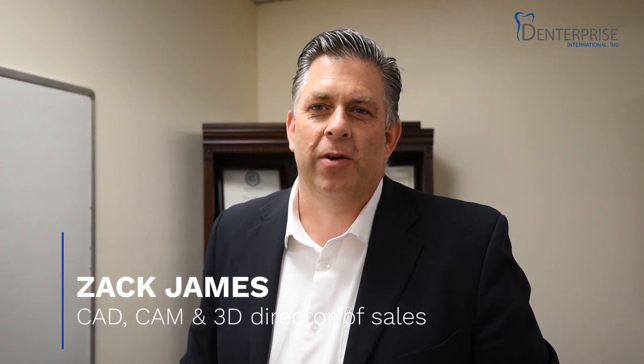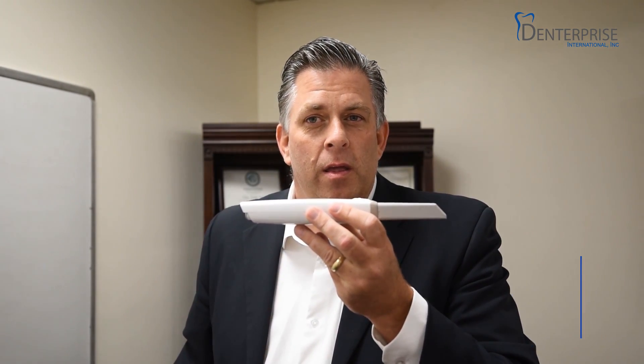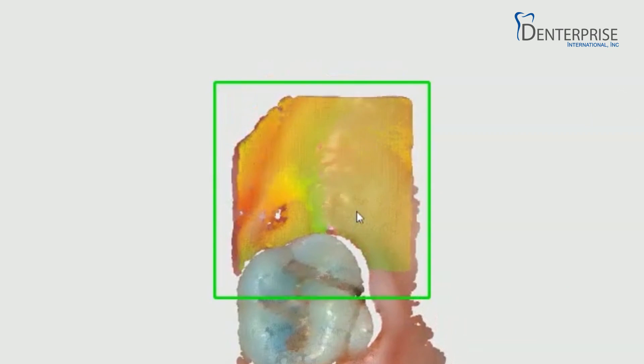Hello, my name is Zach and I'm the director of CAD-CAM and 3D sales for DenterPrice, and I'd like to introduce you to the newest generation in intraoral scanners, specifically the QuickScan iOS. The QuickScan iOS, a high-value intraoral scanner, brings you premium quality at the best possible price.